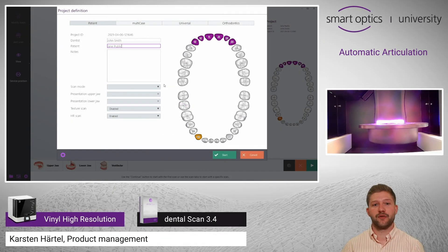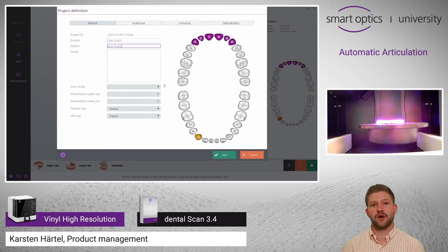This video is about the automatic articulation. With this feature, a vestibular scan is no longer needed.